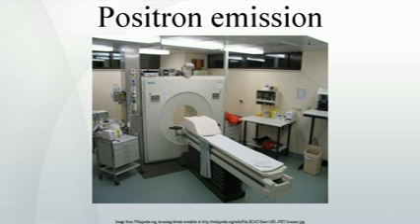Neuropsychology and cognitive neuroscience, to examine links between specific psychological processes or disorders and brain activity. Psychiatry. Numerous compounds that bind selectively to neuroreceptors of interest in biological psychiatry have been radiolabeled with C11 or F18.